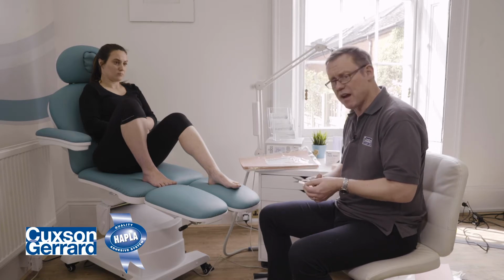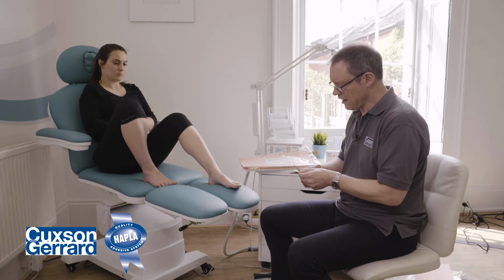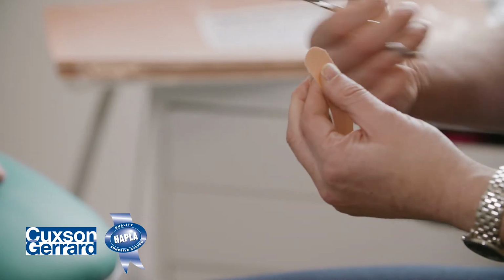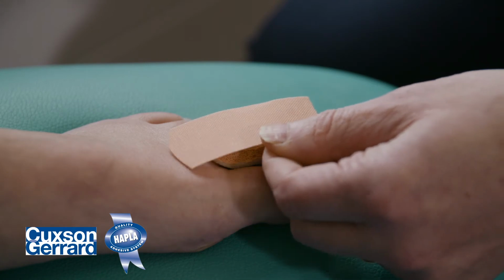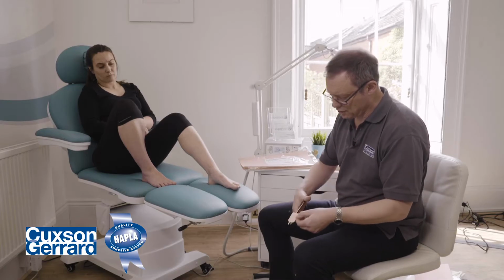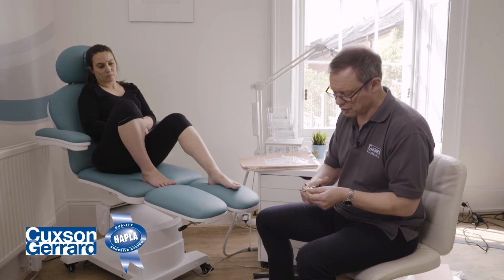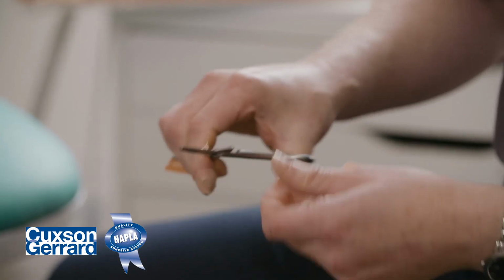This Hapla band has a slight stretch on it, which is really, really useful in this instance. It just helps us to hug into that toe. So we're just going to curve the proximal portion of our tape here. Let's put that on there. So that sits behind the tape just to secure it to the skin. Shorten that, it's a little long. And then we're going to just cut into the tape here, probably about halfway down. Those two shoulders then will hold the shoulders of the pad down. Just round off those edges too, to stop it being grabbed on hosiery.